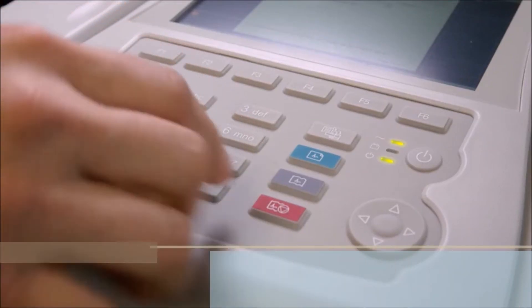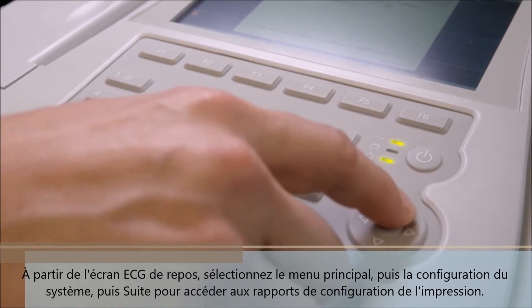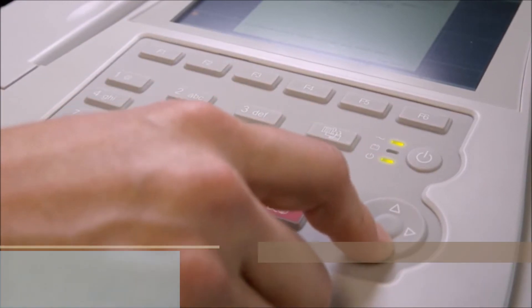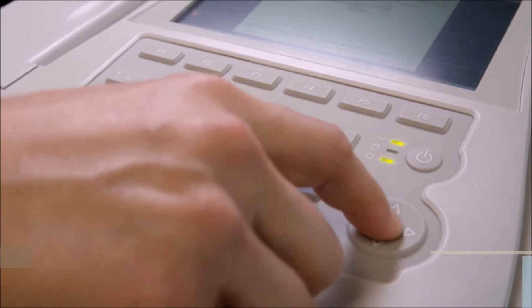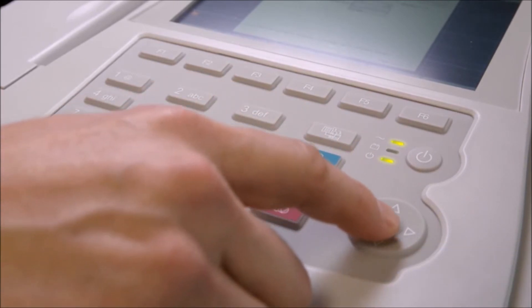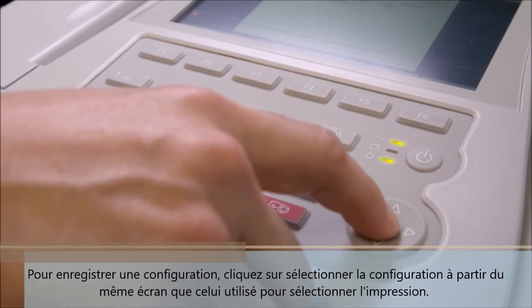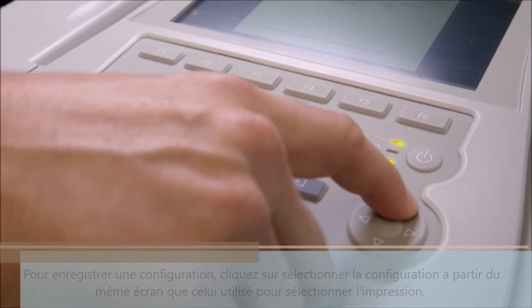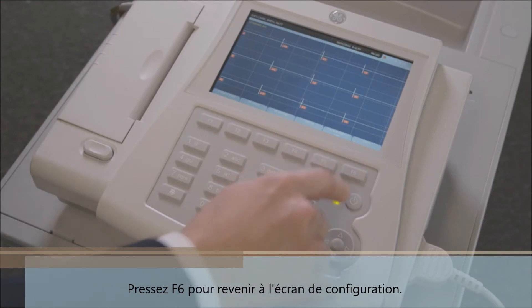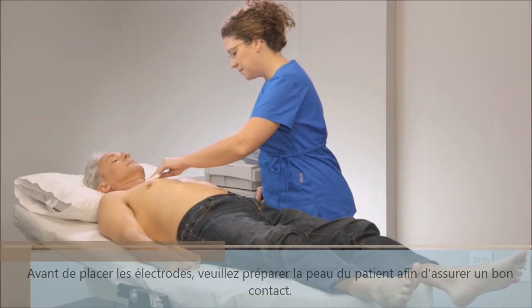From the resting EKG screen, select Main Menu, then System Configuration, then More to access Print Setup Reports. In the pop-up menu, select the report you wish to print. To save a setup, click on Select Setup from the same screen used to select Print. Press F6 to return to the configuration screen.